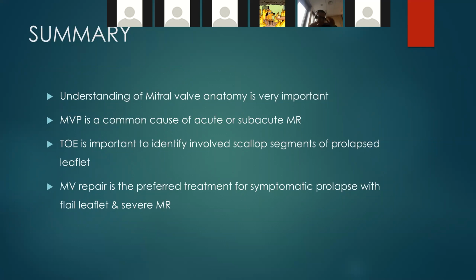Yeah, I just have a question. My practice is uniformly cardiac anesthesia, and I noted that you have some TOE images. I find this with the cardiologists as well. Do you do much 3D echo? Your probes look like they must be capable. In my workflow, the first assessment of mitral regurgitation or mitral valve abnormality is some form of live 3D imaging.